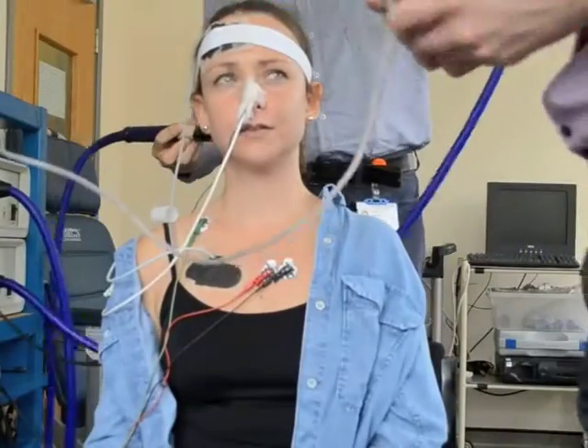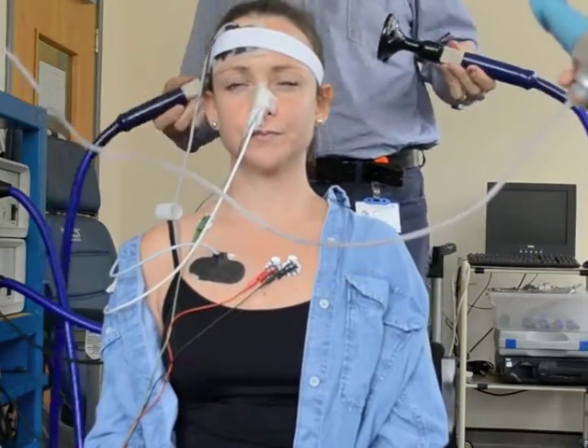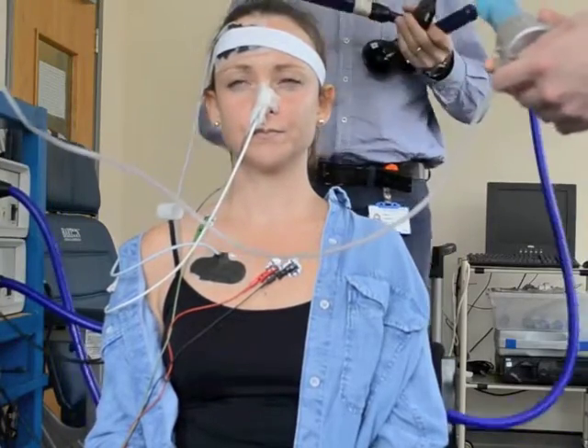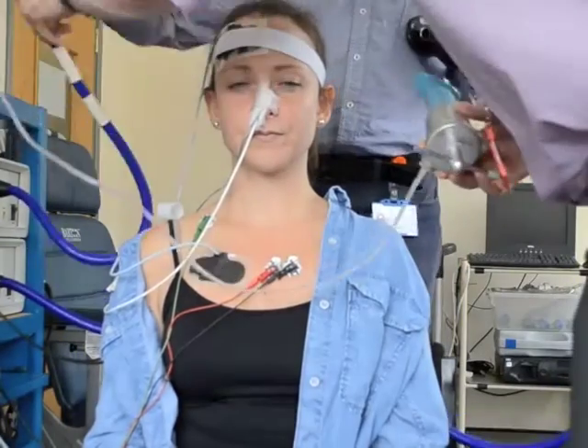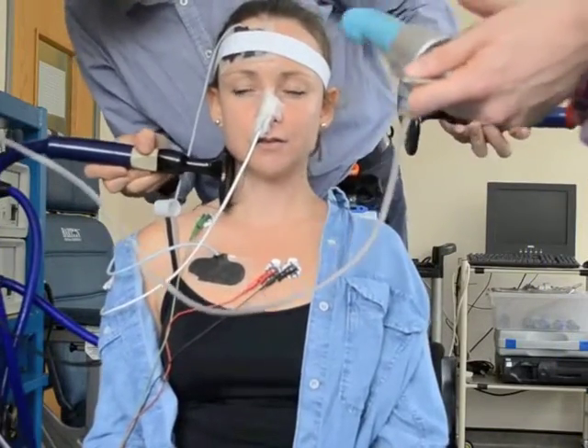The large black magnetic coils placed on either side of Monique's neck stimulate the phrenic nerve, which is the nerve that supplies the diaphragm. This makes the diaphragm contract without any effort from Monique and lets us see how much force it is able to generate.